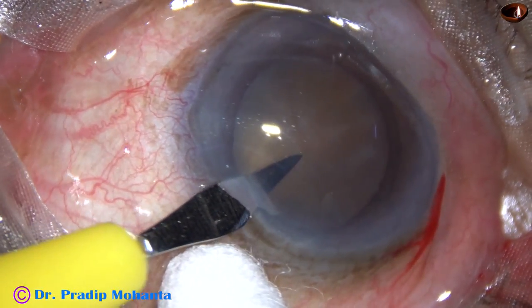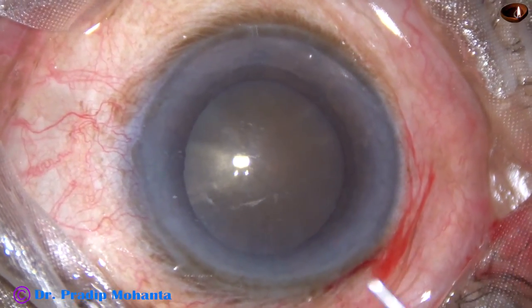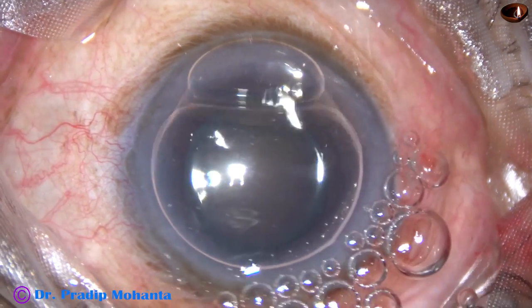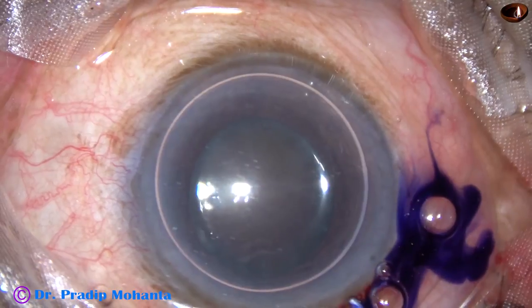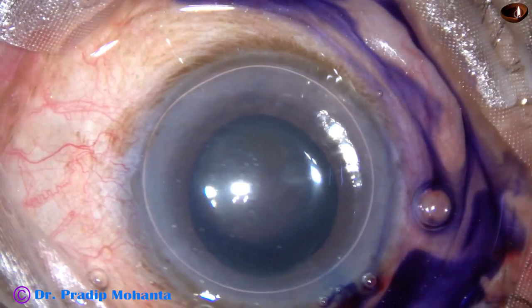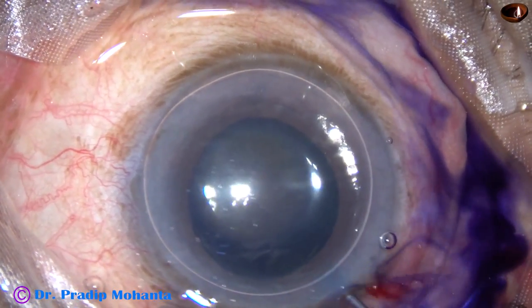By this time, the main incision and a side port on the left side of the main incision have been made. And now the anterior capsule of this cataract is being stained with trypan blue dye underneath an air bubble, because I want to get some contrast during capsulorhexis.